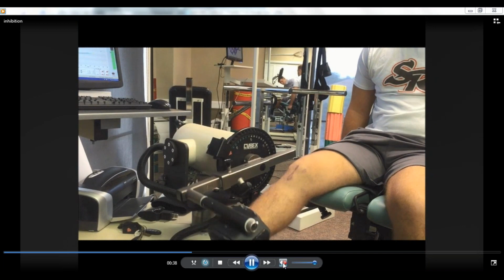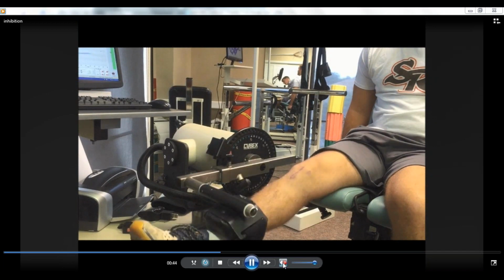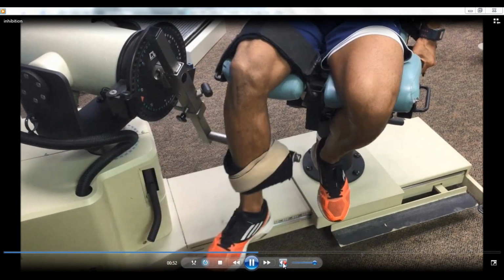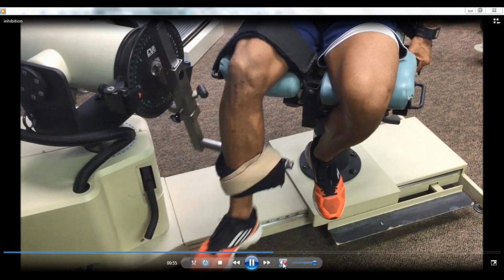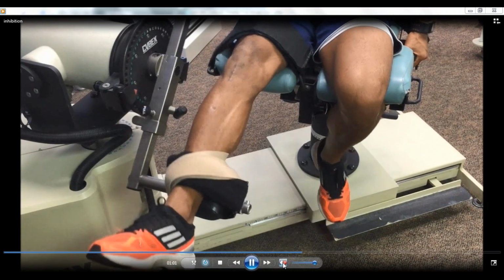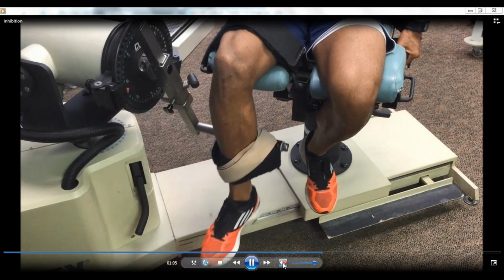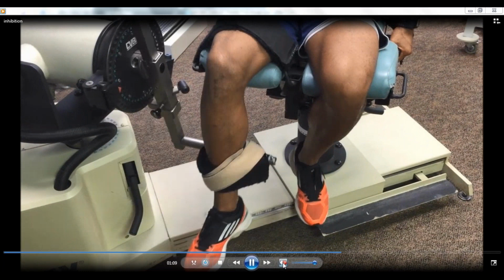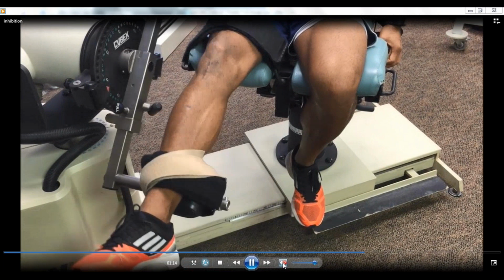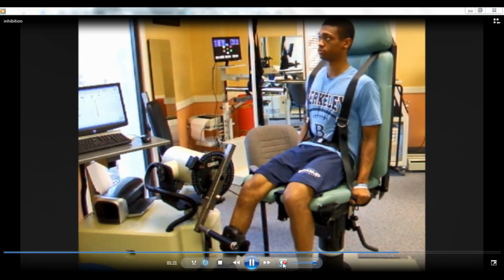We often call this force oscillation in the clinic because what we're actually looking at, especially when you see it on the screen, is almost an oscillation, just like on an oscilloscope, where it moves up and down because the muscle is being turned on and off so quickly. And this is not an adverse reaction. This is just telling you that this patient, at the speed and the torque amount that they're loading, that muscle is still adapting to this. And you want to see this in the clinic occurring here under a safe mode versus going down a stair or doing a single leg jump or a cut, because it will happen then if they haven't trained through it on your machine.